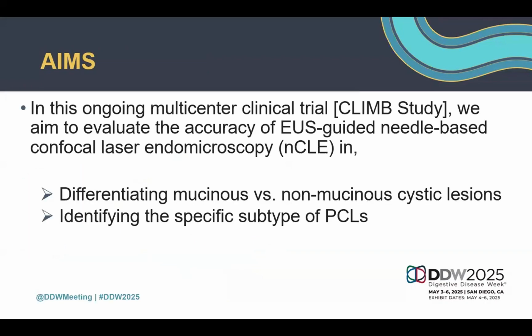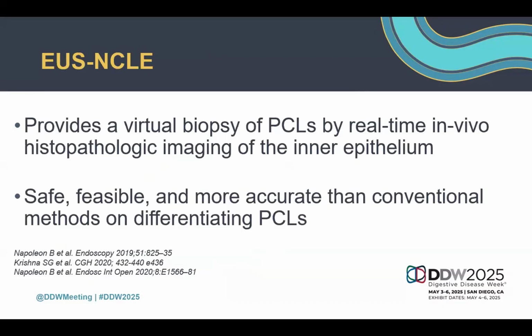Therefore, in this ongoing multi-center clinical trial called the CLIMB study, we aim to evaluate the accuracy of EUS-nCLE in differentiating mucinous versus non-mucinous cystic lesions and in identifying the specific subtypes of the pancreatic cystic lesions. A brief overview and background of nCLE. This is an advanced diagnostic tool providing a virtual biopsy of pancreatic cystic lesions in real time, in vivo histopathological imaging of the inner epithelium. Several studies in the past have demonstrated that it is safe, feasible, and more accurate than conventional methods in differentiating pancreatic cystic lesion subtypes.